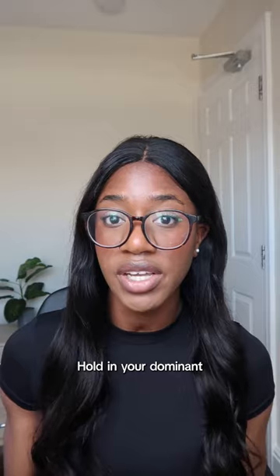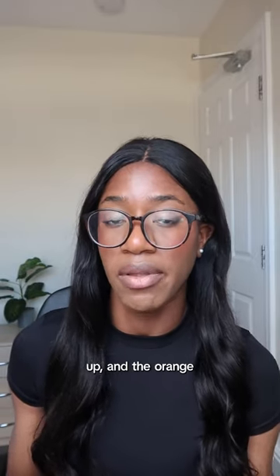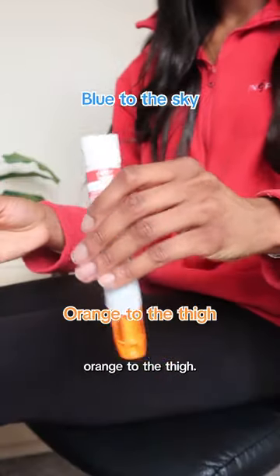Remove it from the case and pull off the blue cap. Hold it in your dominant hand with the blue facing up and the orange facing down. Just remember: blue to the sky, orange to the thigh.